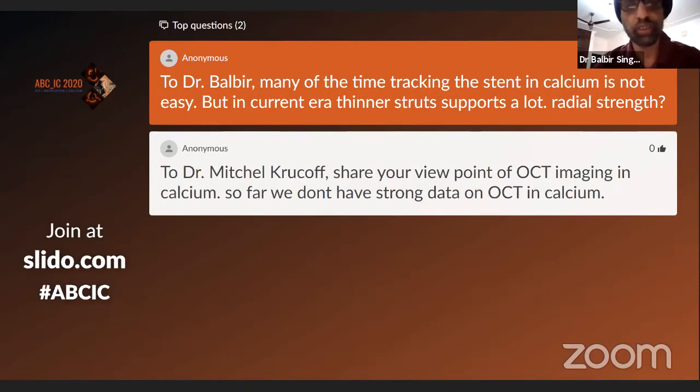Yes, it is true, a thinner strut is more flexible, may go through it. But the fact also remains that if there is calcium and your stent is not crossing, think of creating a better bed, because you may even get through it, but you will end up with an underexpanded stent. And it is very important that if the stent is not tracking very smoothly in a calcific lesion, your bed is not well prepared to handle that stent. So this actually may be a boon, that you get an answer that now you have to prepare your bed better so that your stent expands. Leaving an unexpanded stent is dangerous.